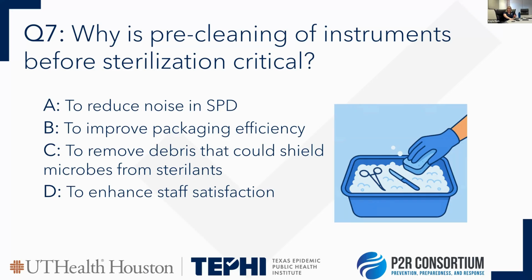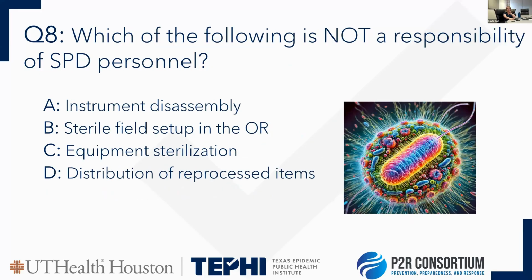If you do not remove the debris, it can cause a biofilm, which kind of shields the specific device, and it can create a barrier where the sterilants can't get in to effectively clean and disinfect it. So that's always why we want to remove that, to make sure that later, in whatever practice, sterilization or high-level disinfection that we have, it is effective.